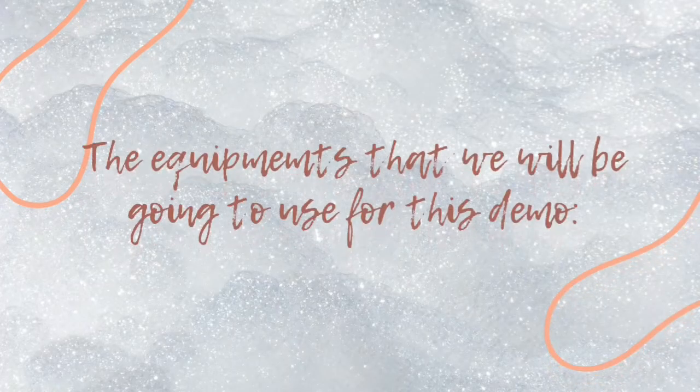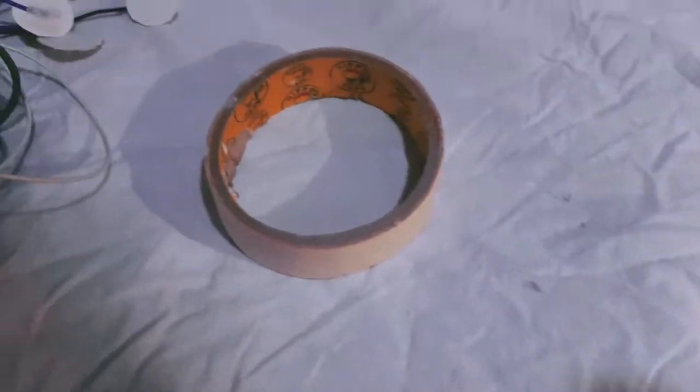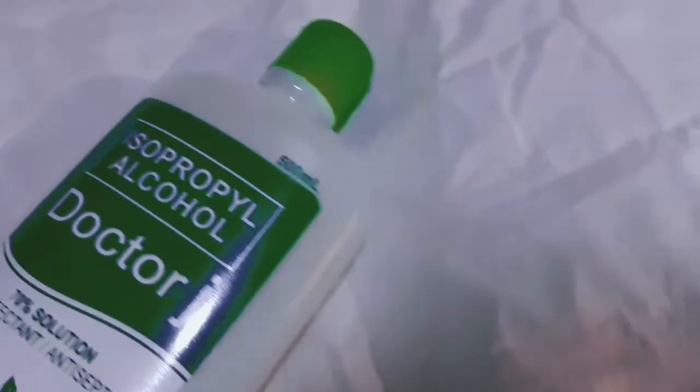The equipment that we will use for this demo: flexible belt, measuring tape, electrodes, gauze, pen for landmarks, pulse oximeter, alcohol, gloves.